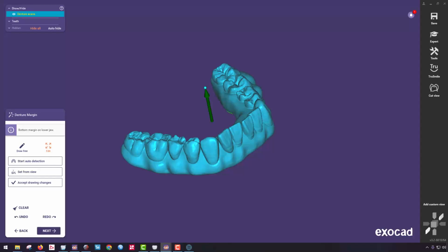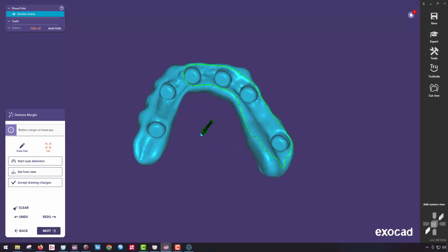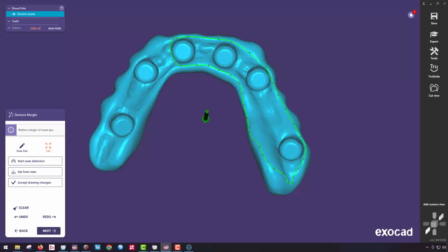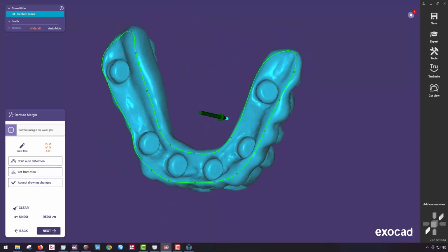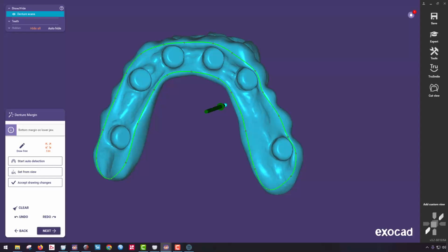Now in the exocad software, it usually begins by finding the gingival margin first. On locator fixed prosthetics, it usually doesn't get this right, and that's okay because I'm just going to clear it off and do it manually. So I click the clear button, and now I'm going to do an outline all the way around, essentially the quote-unquote borders, even though there's no borders just because it's a fixed prosthesis, but this is what I want it to look like. Then double click and inspect from a few different angles. Perfect. And hit the next button.